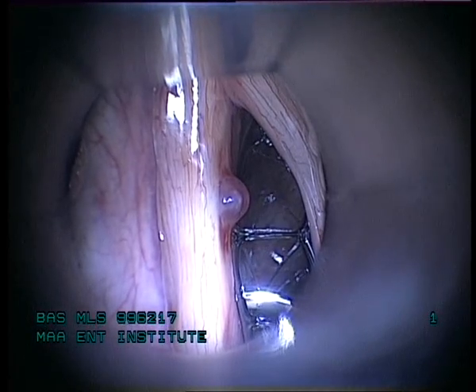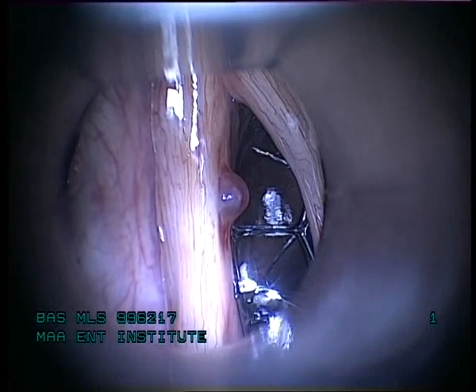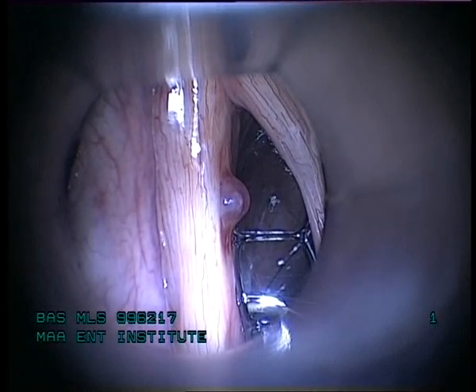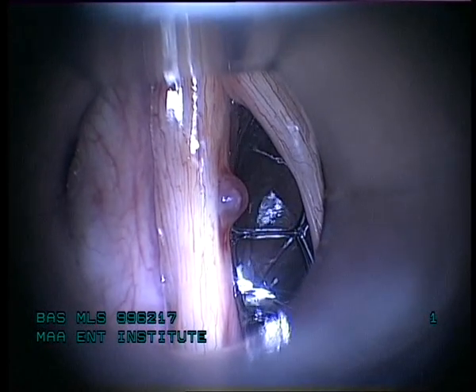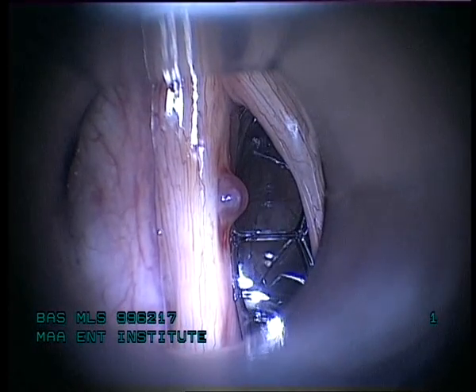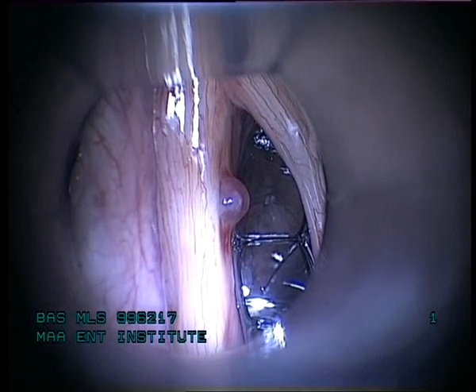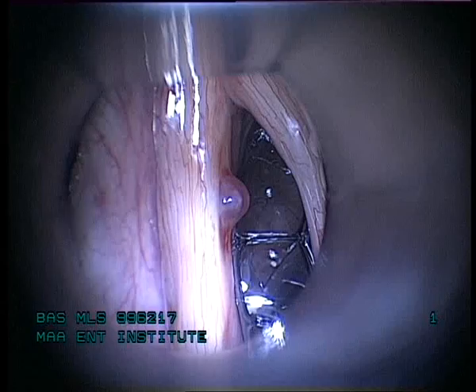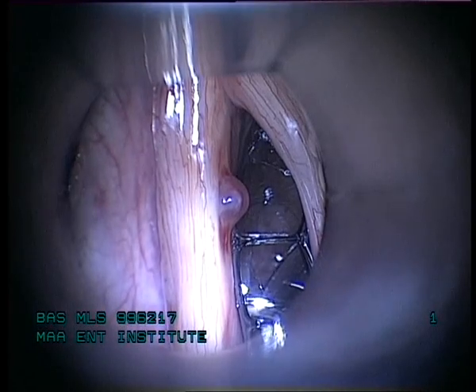We are going to use a robotic laser — the AcroBlade carbon dioxide laser. We are going to use a 4.5 millimeter or 5 millimeter blade with a 0.5 millimeter depth laser cut.